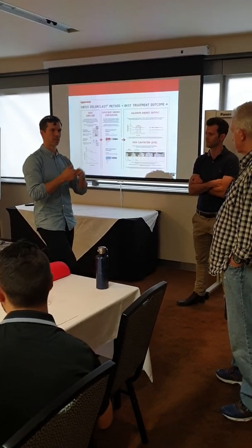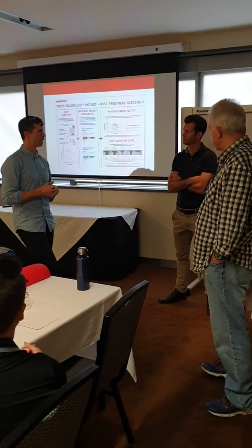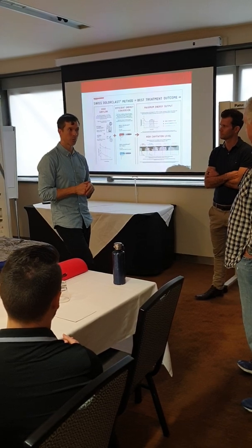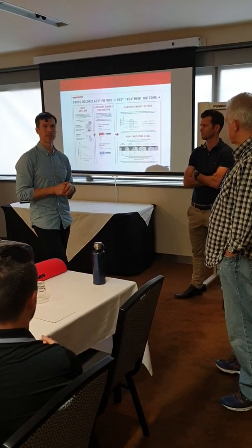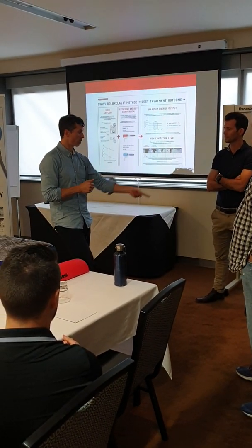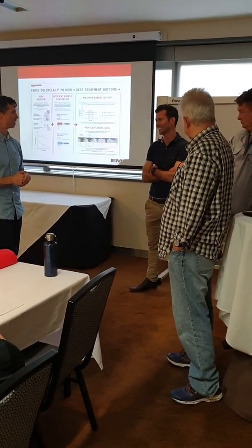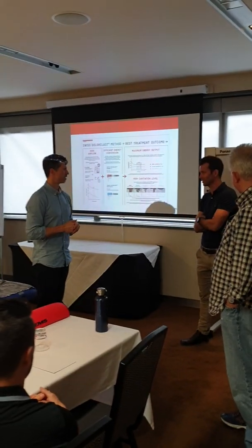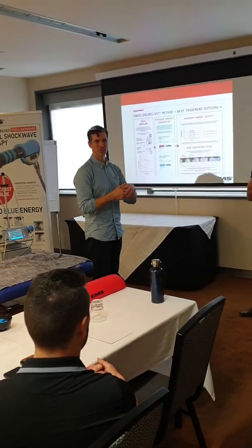I never just look at the Achilles. Again, I do the why. Why is your Achilles having problems? I know your Achilles has a problem, but I haven't answered why. That's where you've got to put on your diagnostician hat and figure out why. Why don't you have it in your other Achilles? Like, you definitely wouldn't go run 20 the next couple of days. But why? Reconstruction on that left knee. Okay, well, there we go. So he's had some knee problems on the left side.